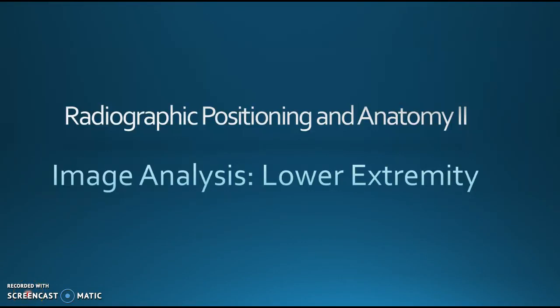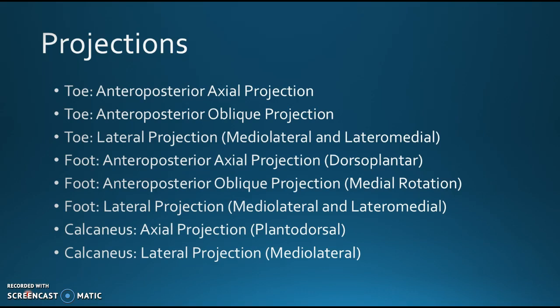Welcome to Radiographic Positioning Anatomy 2. This is your first lecture on image analysis of the lower extremity. The projections that we will cover in this module are the toes, the feet, and the calcaneus.